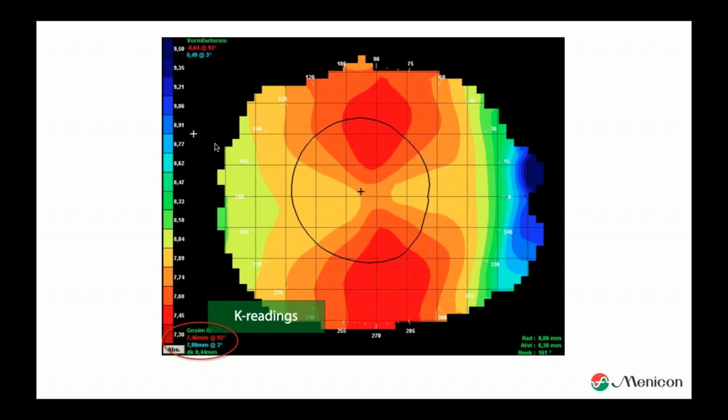Another thing some topographers show you are E-values, eccentricities. If you look more into lens designs and fitting perspectives, E-values will become less important as well. But again, that's maybe something to explain in another topic, in another webinar. But for now, we can do something with E-values as well.